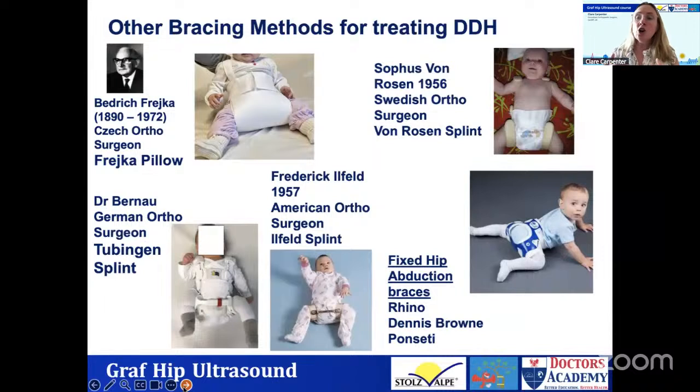And again, once you've come out of the functional dynamic aspect of using the Pavlik, you can choose, if you want to, to go for a more static type of splint in the maturation period. And some of the literature says that if you fail to stabilize with the Pavlik, of course you can go on and use another splintage technique.